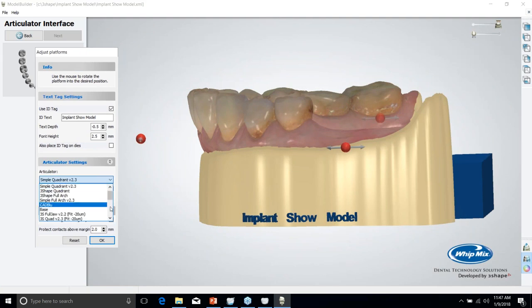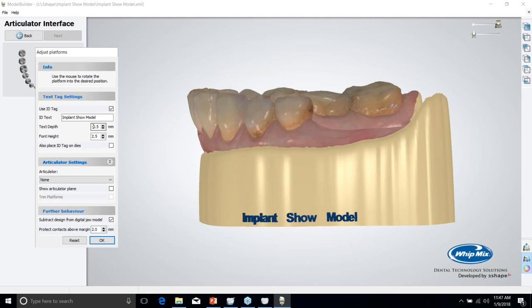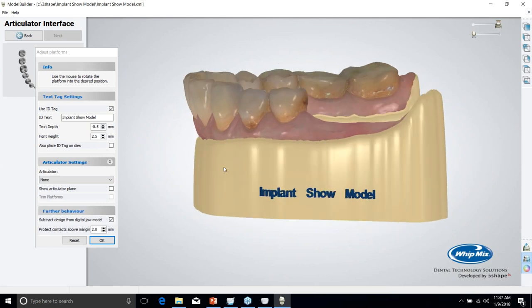And so here I can add an articulator if I want, but I don't have an opposing arch, so I'm going to say none. I can give it a label. I can move my label around. And then under further behavior, you have subtract design from digital jaw model. If you're not going to be printing a soft tissue piece for this, then you do need to do this subtract design from digital jaw model. Otherwise, if your design impinges on any tissue, then it's not going to seat.